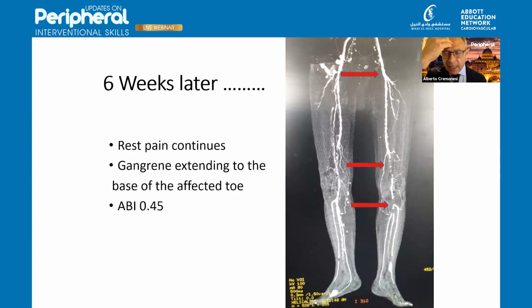Generally we use directional atherectomy if we want to obtain an important result, but you can perforate, you can dislodge a lot of material distally, and I'm not convinced that in that specific case it is the best for the patient.